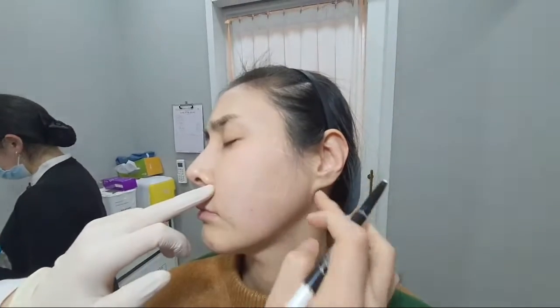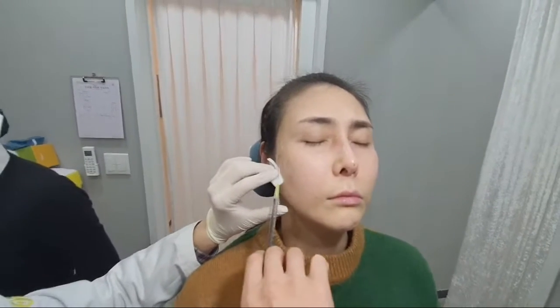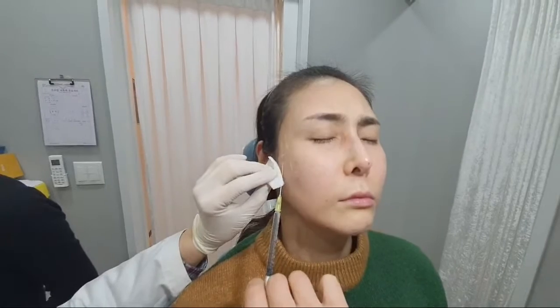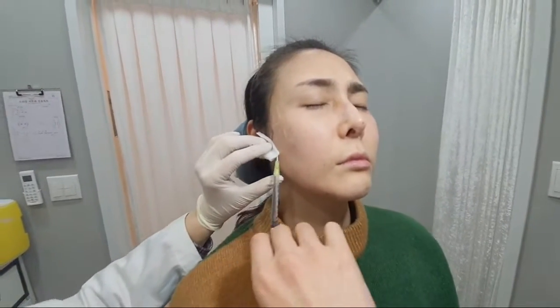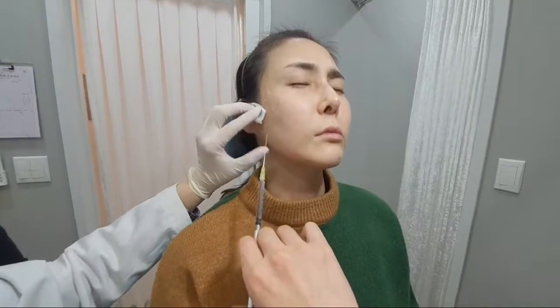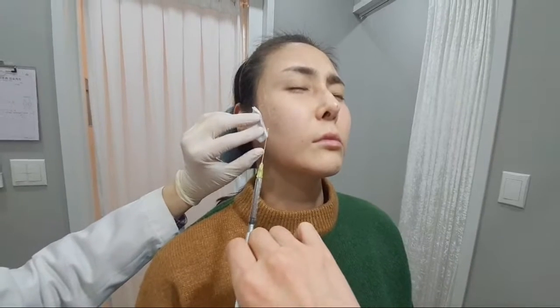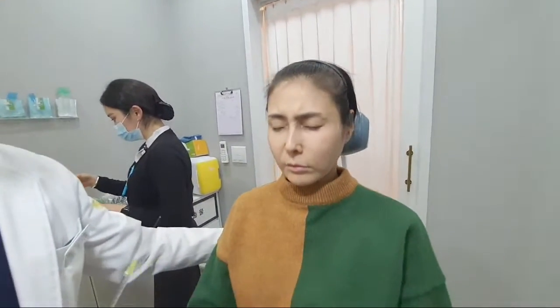귀하고 어느 정도 이렇게 오케이. 뒤로 기대시고 턱 한번 들어보세요. 편안하게 그냥 딴 생각하세요. 간단히 거의 다 했어요 이제. 그럼 다리 맞추고 조금 했어요. 어지러워요? 자, 좀 어지러우면 쉬어. 네, 뒤로 기대보세요. 좀 편하게 거예요.